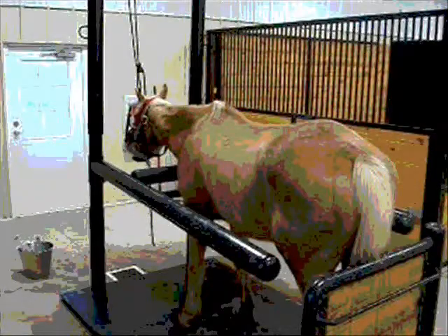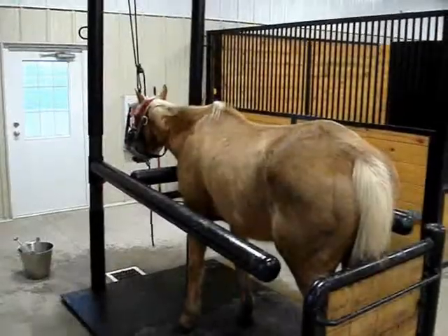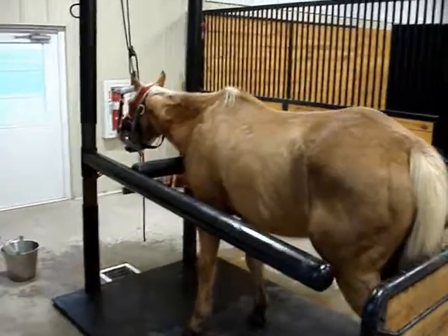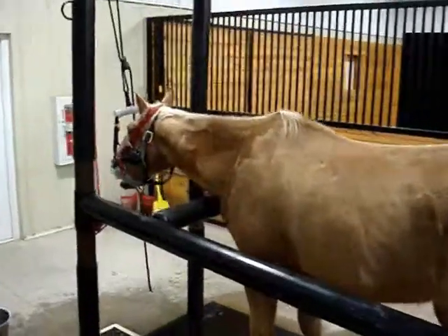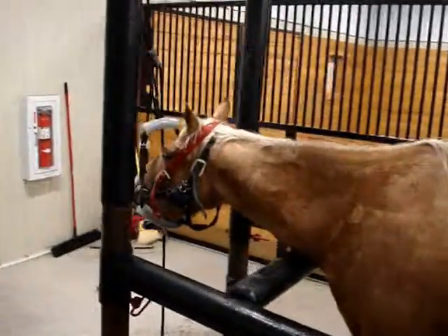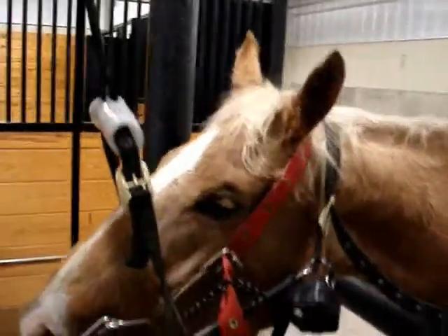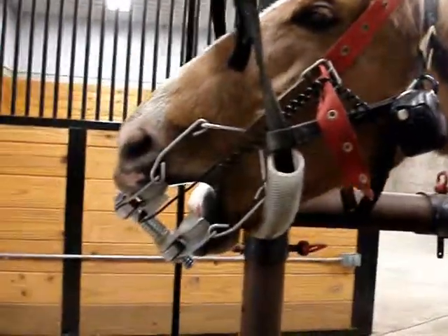This is a video walkthrough explaining our procedure for equine dentistry. First, the horse must be sedated. A full mouth speculum is applied to the mouth. This speculum allows us to open the mouth to the desired width. We have a bright mouth light that is placed on the speculum that allows the mouth to be better visualized, especially the rear teeth.